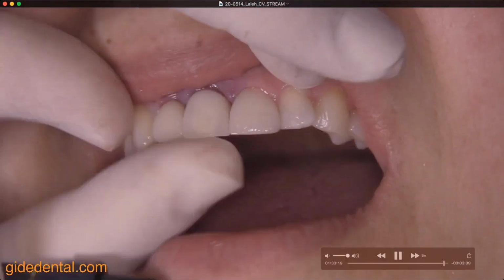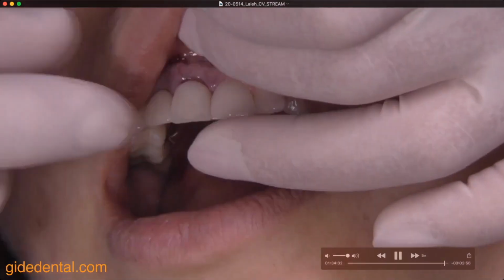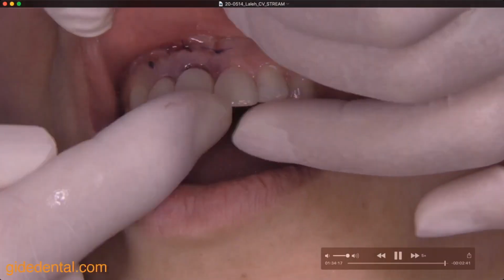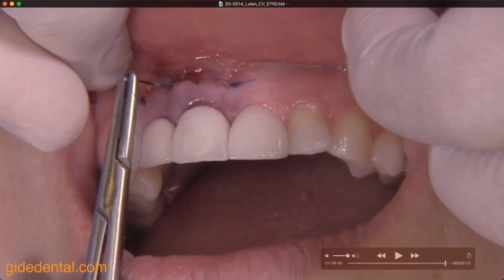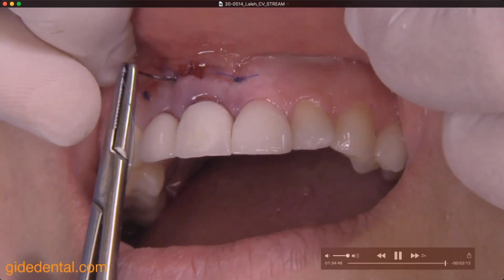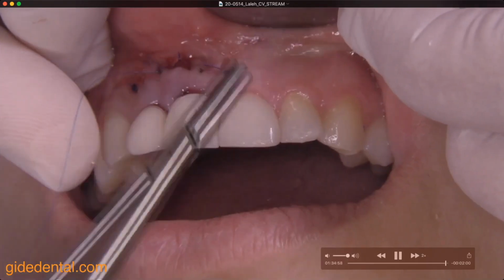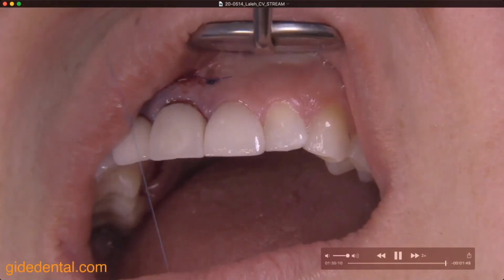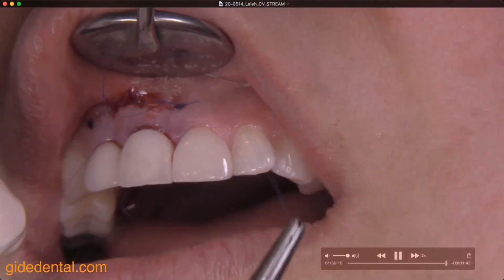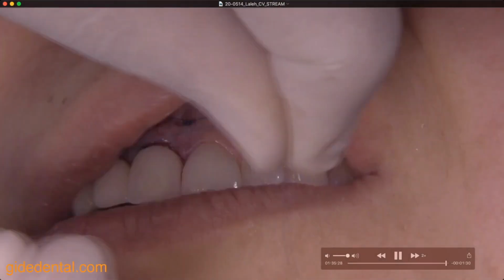Closing the opening of the palatal side. So again, checking, because you added some composite on the palate, that there's no occlusal interference. And here's what I want to show you as a final. So I'm moving now a suture through the buccal space. I don't need to go to the connective tissue. I go quite deep with this suture. It's pretty much a full thickness suture. And then, as you can see, I'm moving it in a coronal direction. So this is a coronal repositioned suture.